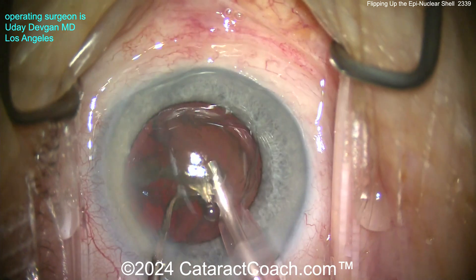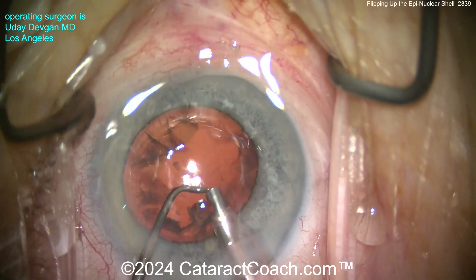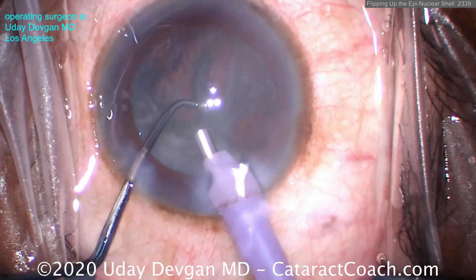As soon as I grab it, I use the chopper to flip it up — now look how easy it is to aspirate. Basically very minimal phaco energy; you just need the vacuum, you don't need phaco power for that. So you want to just do a little gentle vacuum.